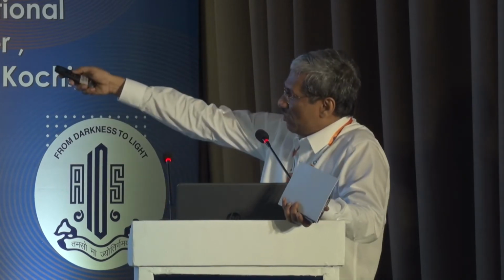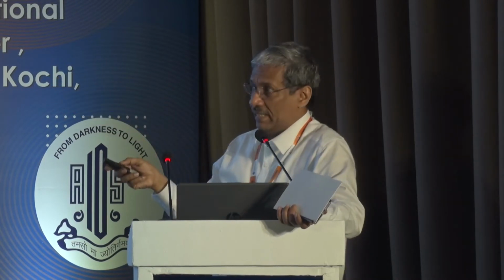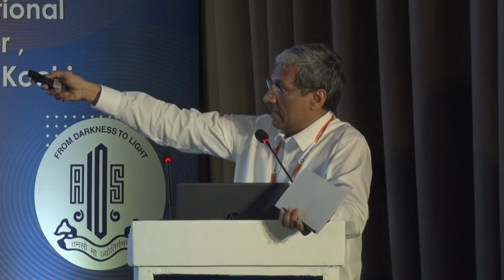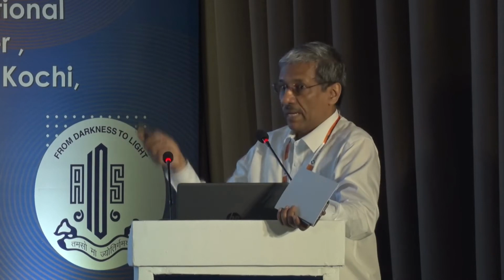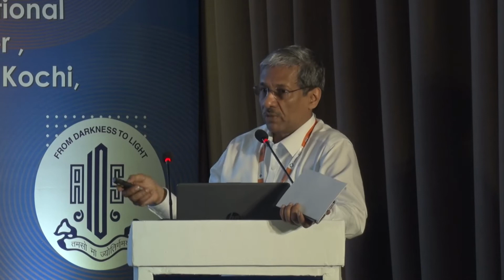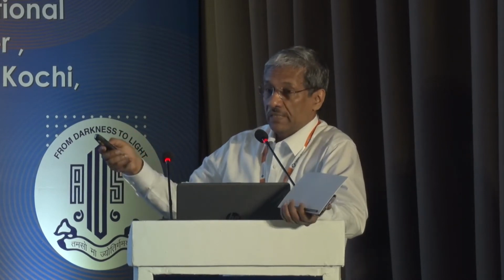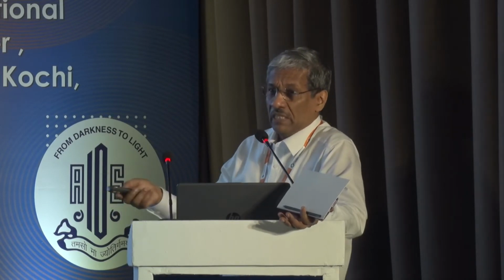Here, a very flat cornea, 40, 39. So most probably, myopic LASIK has been done, and you can see that the axis of the cylinder is not even. There's irregular astigmatism in this patient. So when you see maps like this, you're likely to make the correct decision about whether you want to talk to them about a multifocal lens, or a toric lens, or a standard lens. So when the data comes to you, you can straight away confidently talk about the options to the patient.